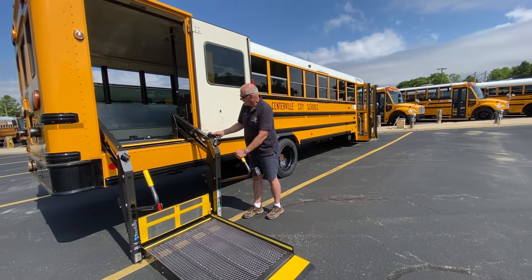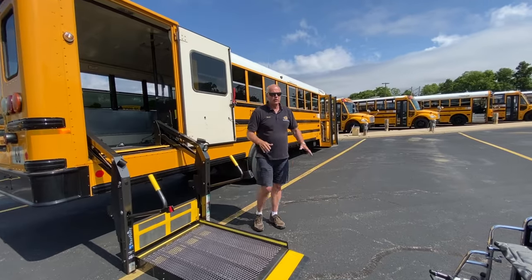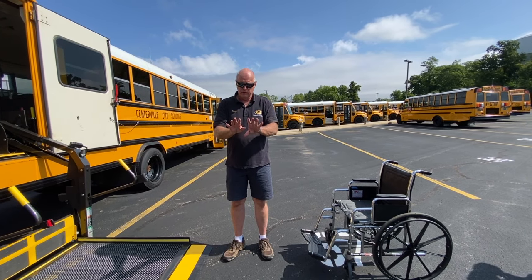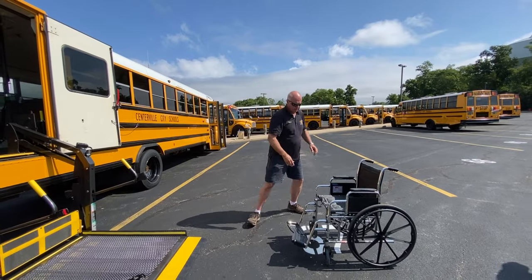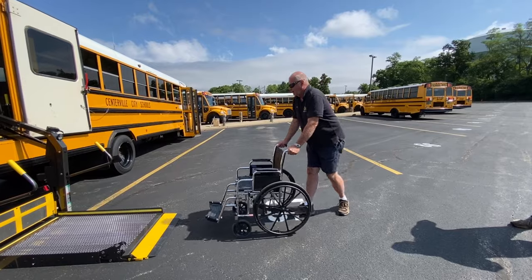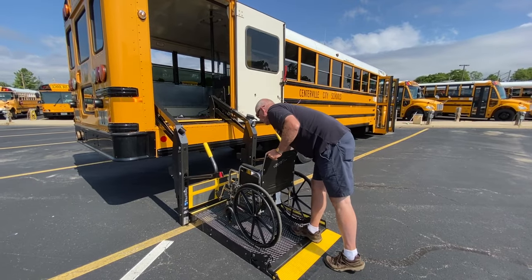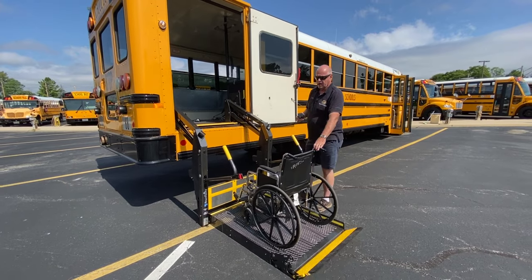When we load a student on, we want to turn the chair around and back it up. I'm going to show you the improper way to do it so you'll understand why we do it the other way. We're going to unlock the chair. Improperly, I'm going to put the chair on facing forward because some might think it's easier to go in on the bus this way. Lock the chair, come around to the side, start to come up.